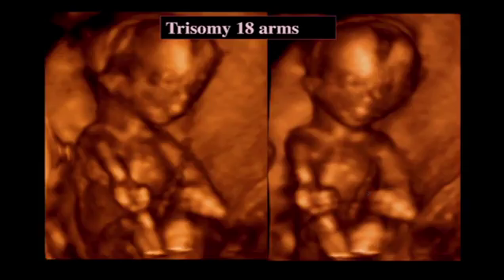Now here's a fetus with trisomy 18, and you can see that both forearms are abnormal, short. The ulna is foreshortened, the radius is not there, and that's why the hands are clubbed and coming back forward. This fetus also has micrognathia and had a number of other abnormalities associated with trisomy 18.